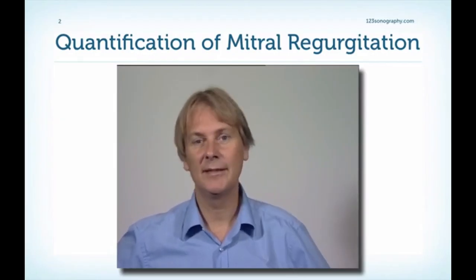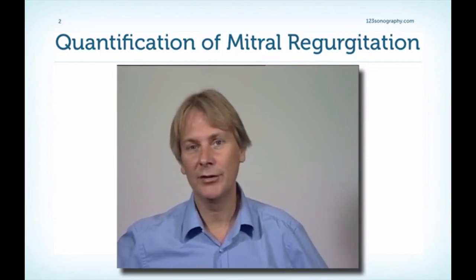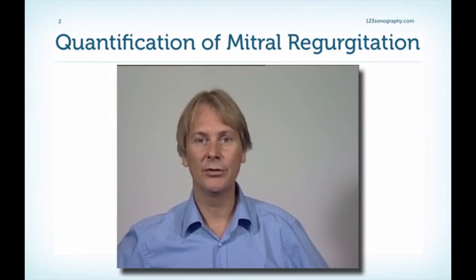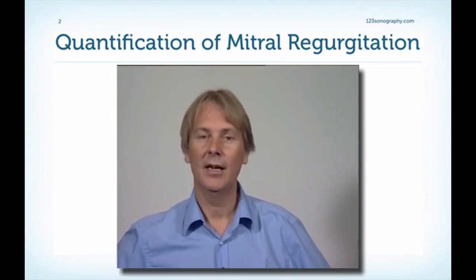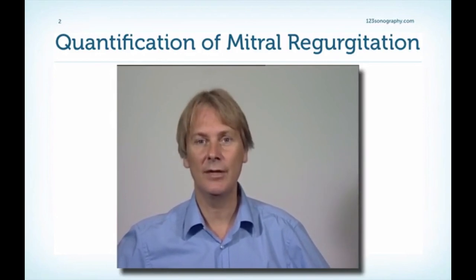Well, I hope you will not be disappointed with the following chapter. You will probably expect some kind of a number that you will generate to quantify the severity of MR. I have to disappoint you, there is no such number. Again, we will have to use many different things. We have to put pieces together to come to a diagnosis.